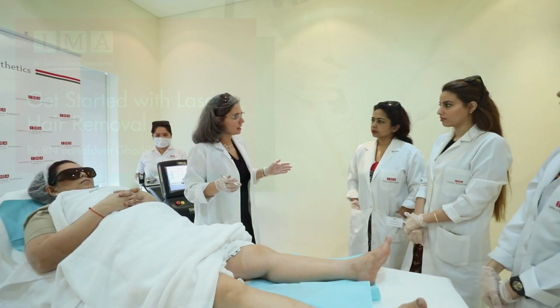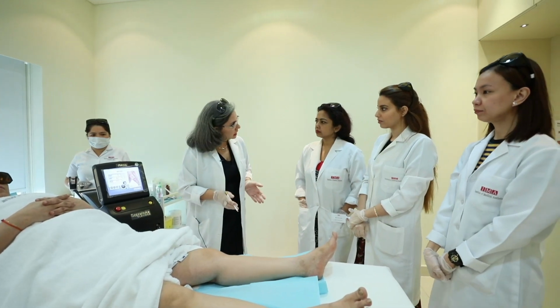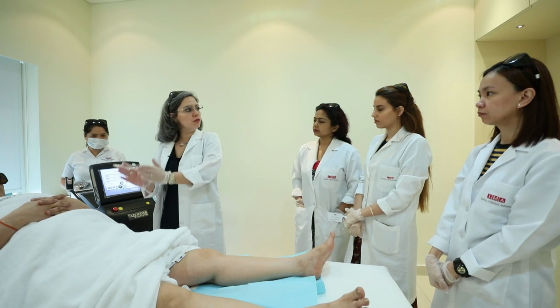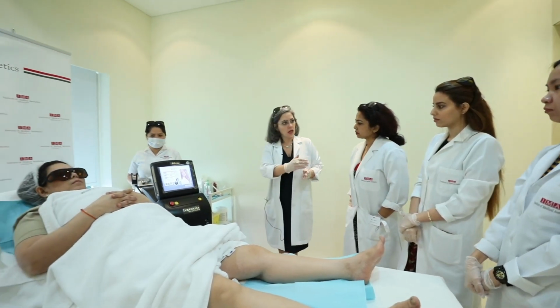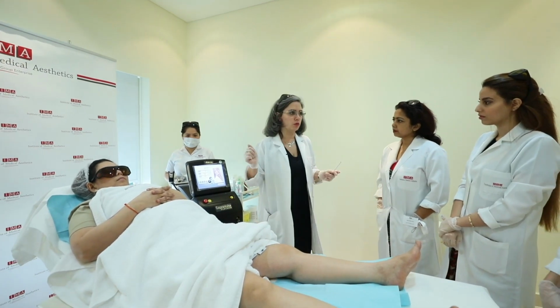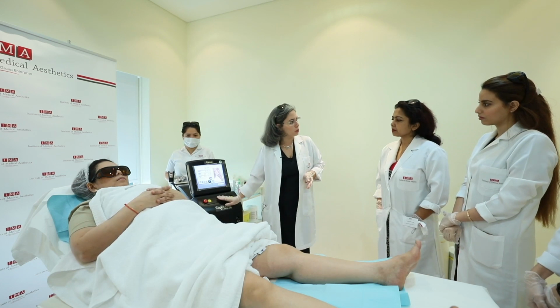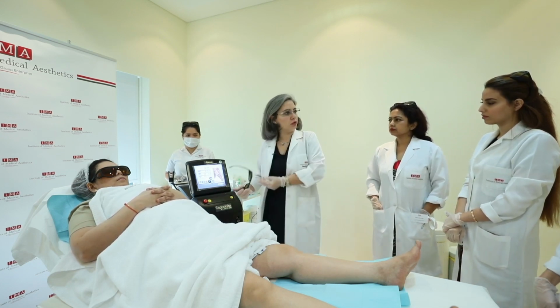Now that we supposedly know information about fundamentals of skin, Fitzpatrick skin type, and laser safety, before we move forward looking at the patient, first check around the safety considerations of your room. First of all, you have to know the wavelength that you are treating the patient with. The goggles that you have in your hand should be appropriate for this wavelength.